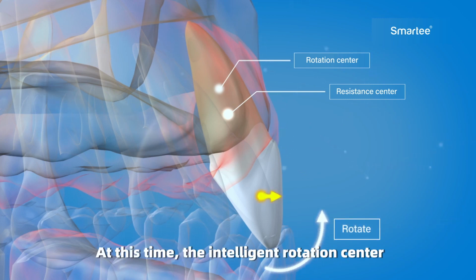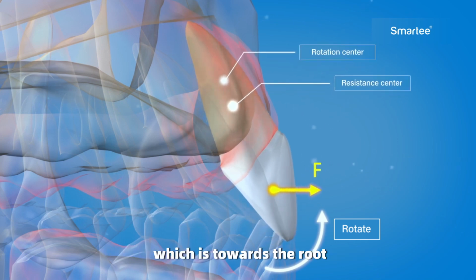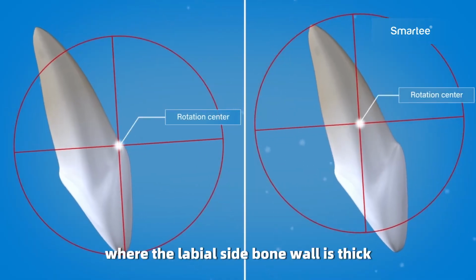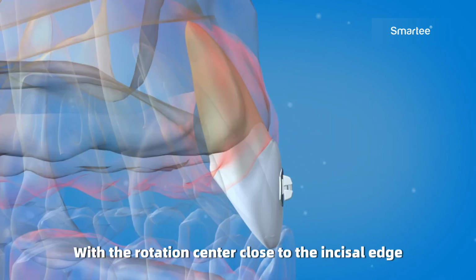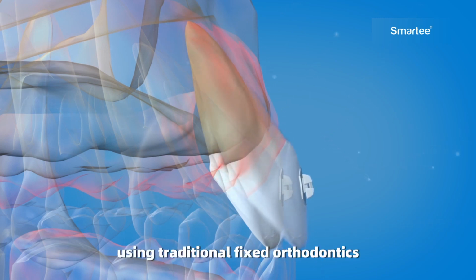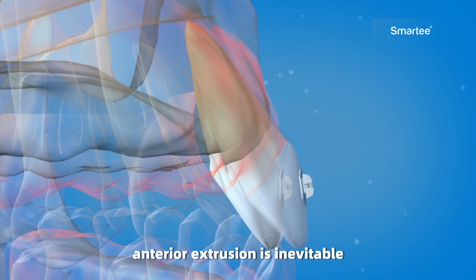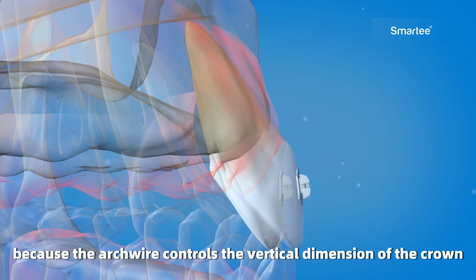At this time, the intelligent rotation center can be placed in the resistance center, which is towards the root, and is suitable for anterior crossbite cases where the labial side bone wall is thick. With the rotation center close to the incisal edge, it can reduce the relative intrusion, and vice versa. When relieving anterior crossbite using traditional fixed orthodontics, during the anterior proclination after leveling the occlusal plane, anterior extrusion is inevitable because the arch wire controls the vertical dimension of the crown.